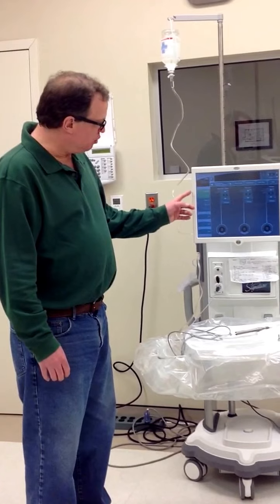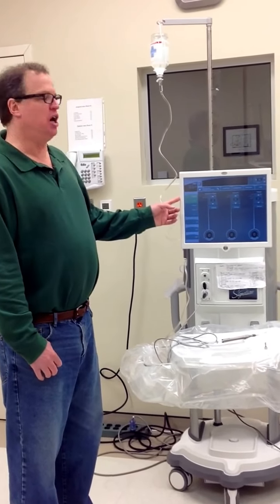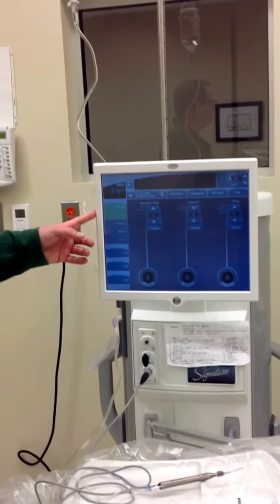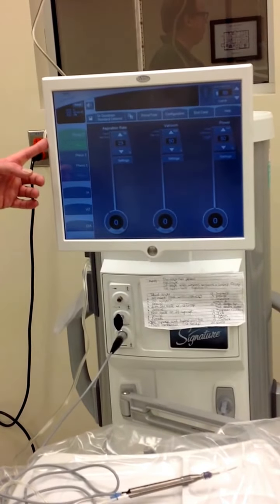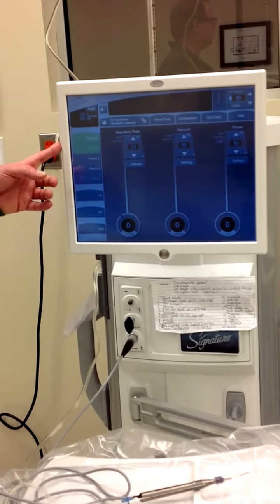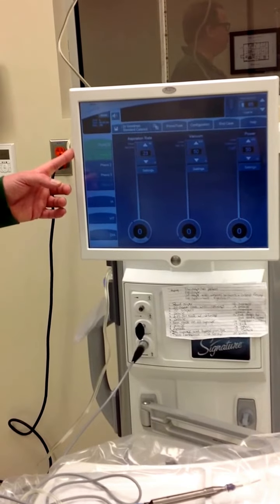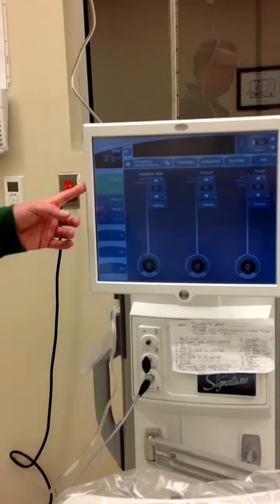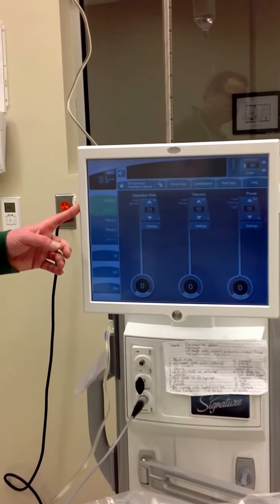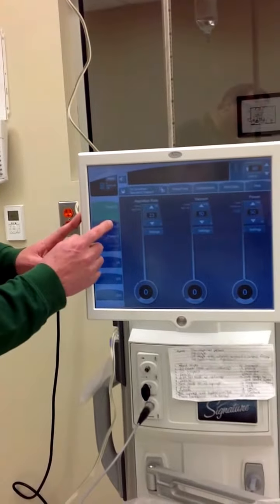So now the machine has finished its prime and tune cycle successfully, and what it's done is gone to the first operating screen. So, phaco 1 is the first stage in most doctors' procedure. It's used for putting a groove or two, particularly in divide and conquer, into the nucleus. After they groove the nucleus and they crack the nucleus, the next phase is phaco 2.